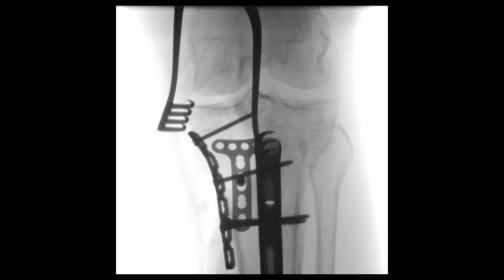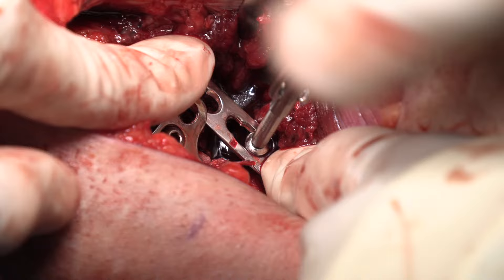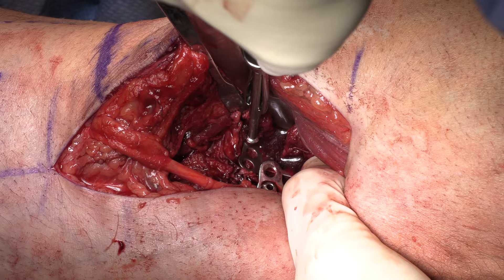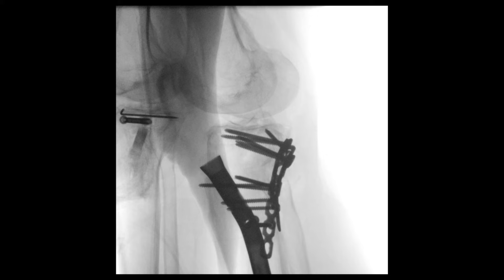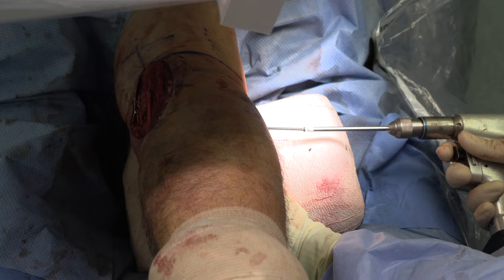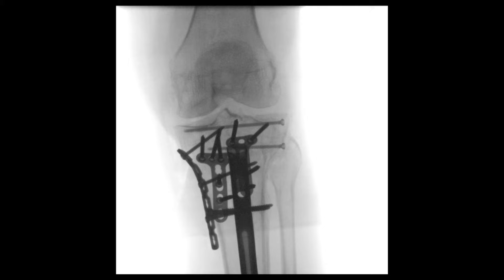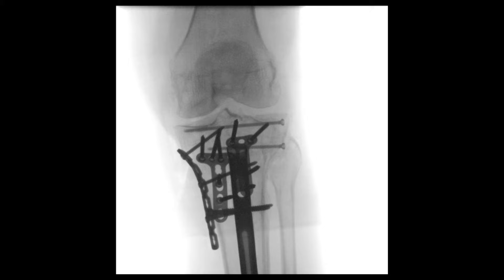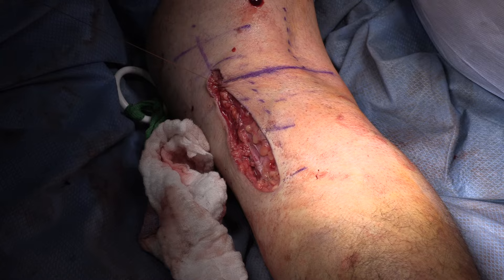Attention is then turned to the lateral plateau. The lateral joint line is reduced and an additional 4-by-3-hole T-plate is placed in buttress fashion on the posterior lateral aspect of the tibia with a combination of cortical screws and locking screws. All screws were placed around the patient's IM nail. To increase fixation of the lateral plateau, additional percutaneous fixation was used. Two 1 cm stab incisions were made over the anterior lateral aspect of the tibia and two fully threaded cortical screws were placed from the anterior lateral aspect of the tibia to the posterior medial aspect. Fluoroscopy imaging confirmed appropriate placement of all hardware and maintenance of reduction, with all screws confirmed to be extra-articular.